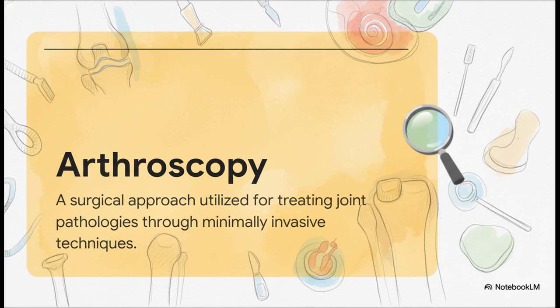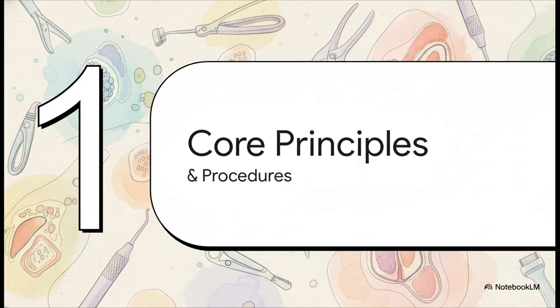So, let's start with the basics. What exactly are we talking about when we say arthroscopy? At its core, it's our surgical gateway for treating problems inside the joint. Think of it as our minimally invasive window. It lets us perform targeted procedures without the major trauma that comes with the full open arthrotomy. It's a game changer.